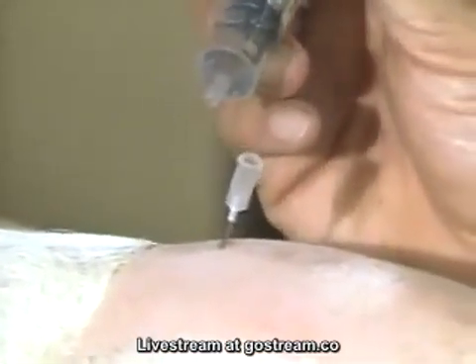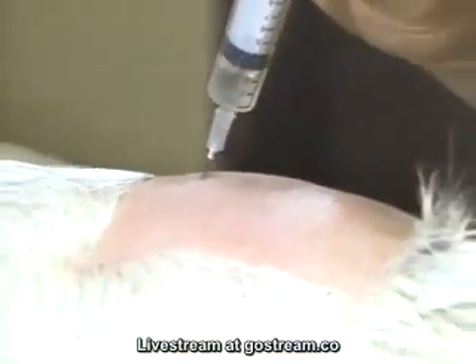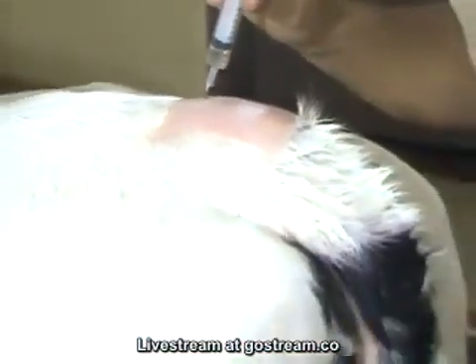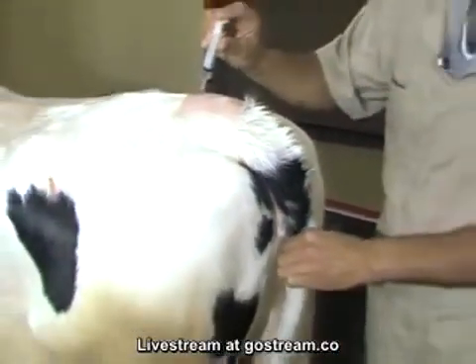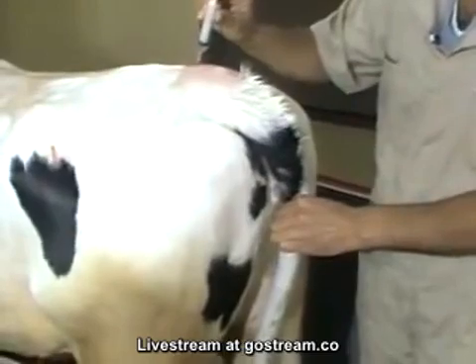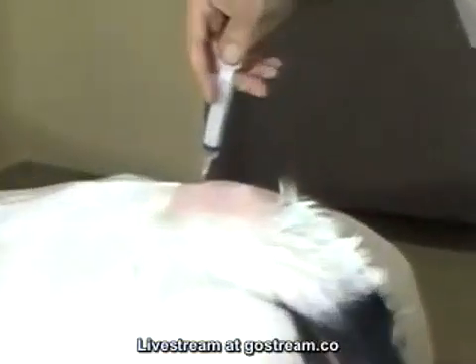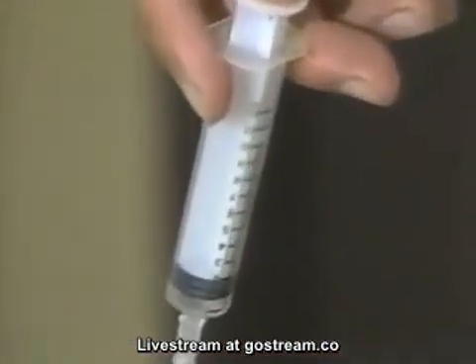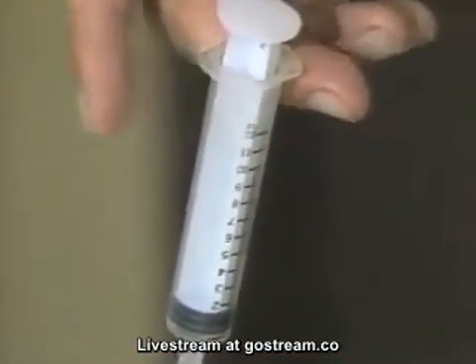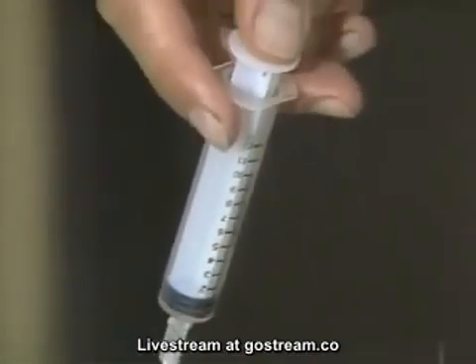We'll not put this cow down. At that point we'll attach the needle, stay in the same site, and make an injection. The plunger should almost fall in. One other test is when you're pushing on the plunger of a disposable syringe, you shouldn't blanch your thumbnail — or you're not in the right spot.